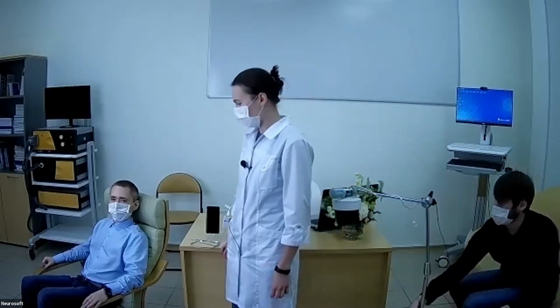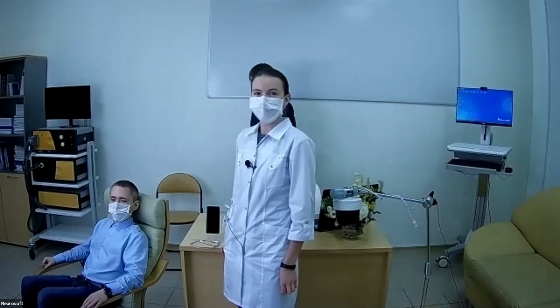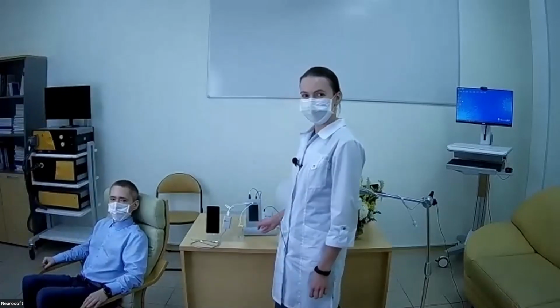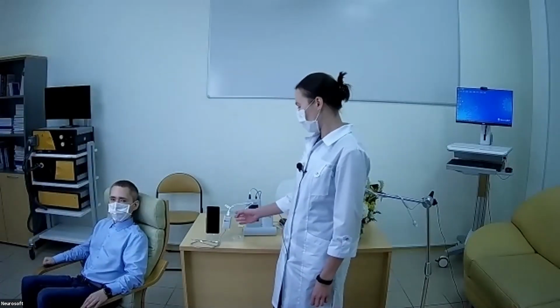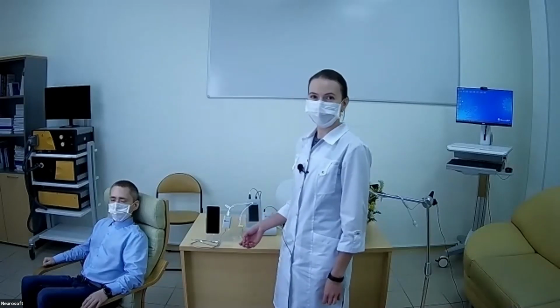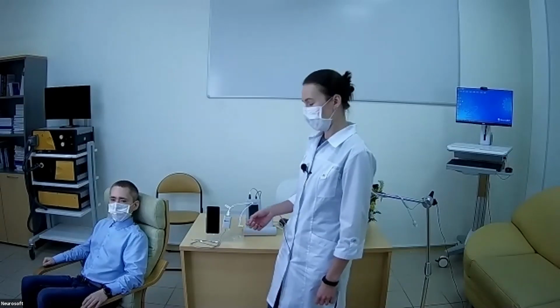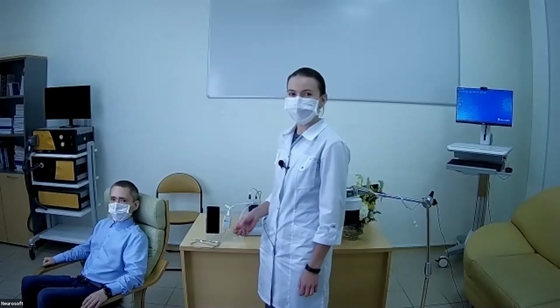As Michael said, it helps us to evaluate the state of the cochlea. And actually, we can use both of our portable devices for this aim, aScreen and AudioSmart, but today I will show you how to perform the transient evoked otoacoustic emission and distortion product otoacoustic emission test using the aScreen device.